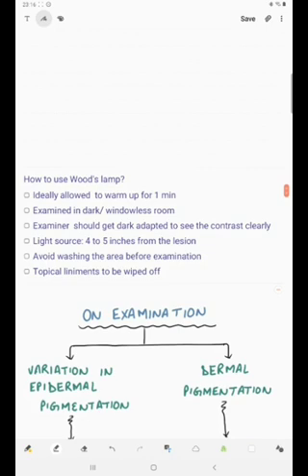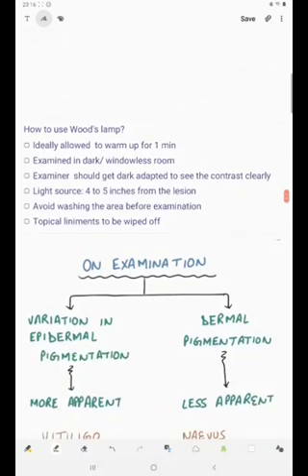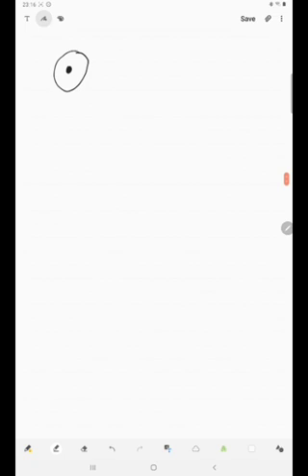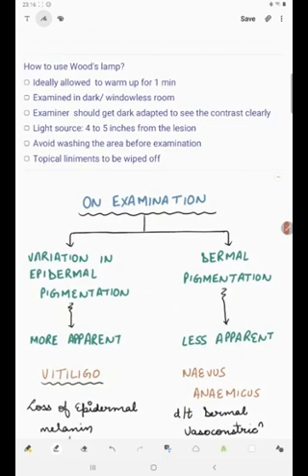How to use Wood's lamp. Ideally the Wood's lamp is allowed to warm up for one minute. It is to be examined in a dark or windowless room. The examinant should get dark adapted to see the contrast clearly because whenever we come from a lighted room, our pupils are usually constricted. The light source should be 4 to 5 inches from the lesion. You should avoid washing the area before examination and any topical elements that have been applied are to be wiped off.